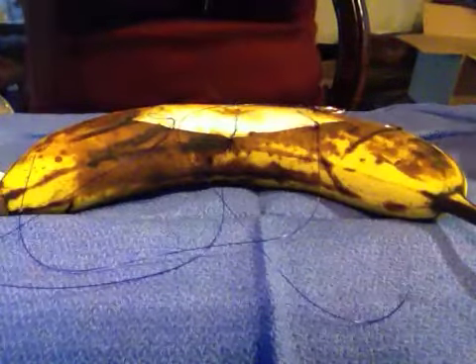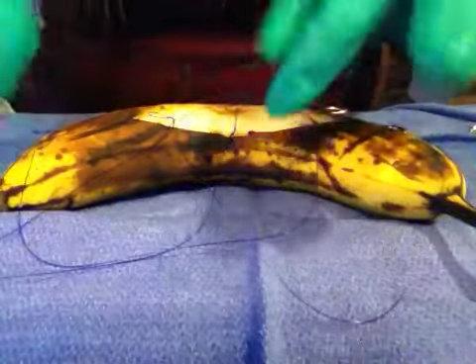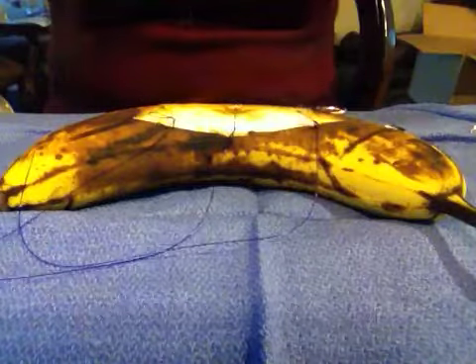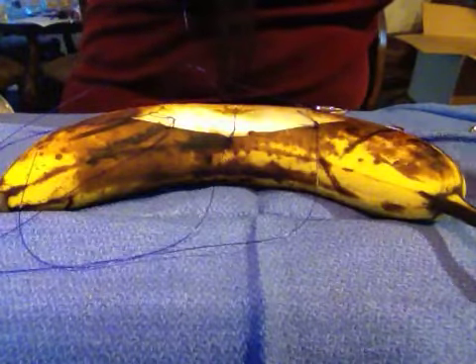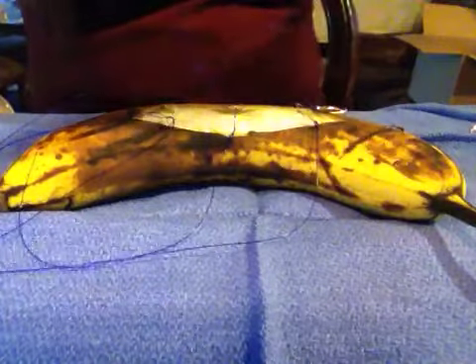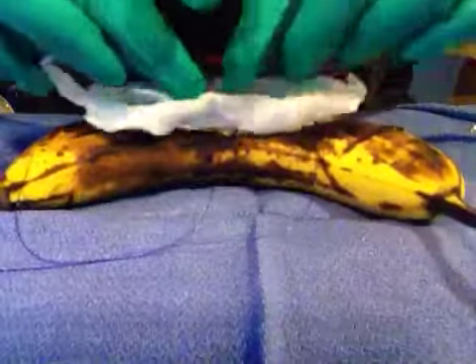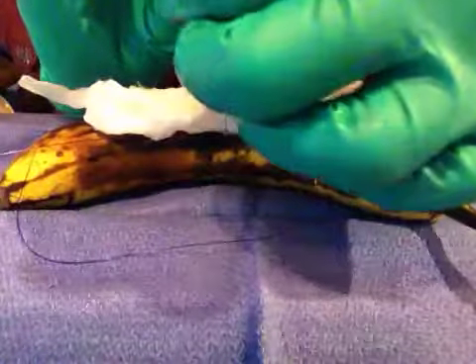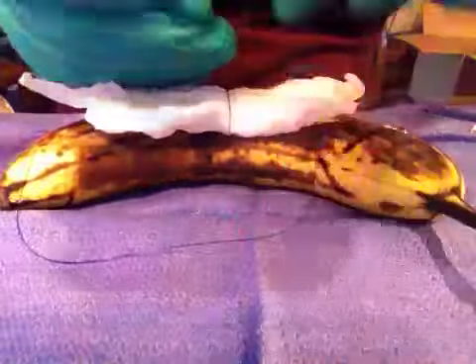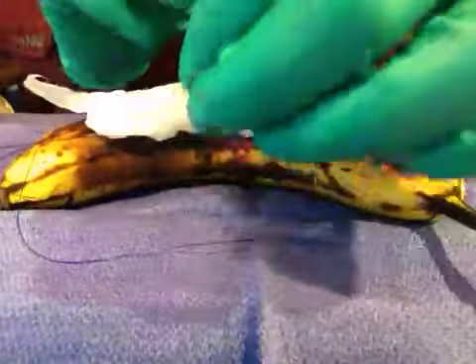Okay, there we go. Put the needle in the needle mat. Okay, I have one, two, three sutures on this side. One, two, three sutures on the other side. So I have my nice wet gauze — I'm going to pretend it's a ray tack, really it's kind of fluff. So I'm going to tie the middle one first. One, two, three.